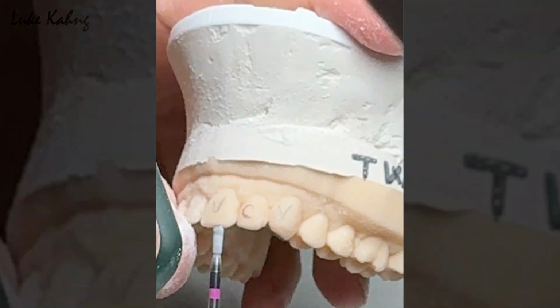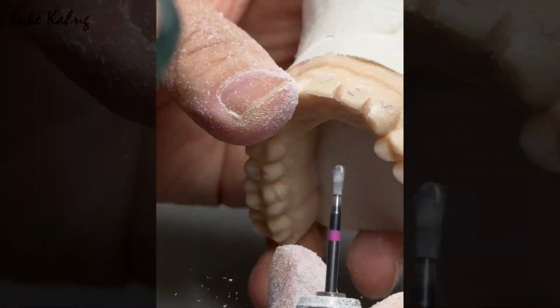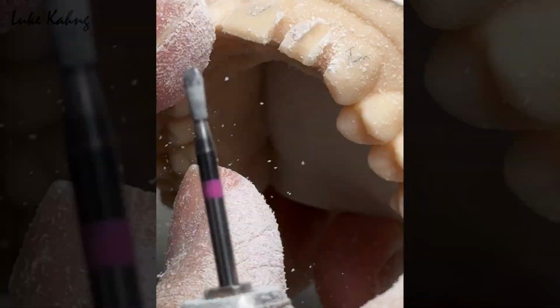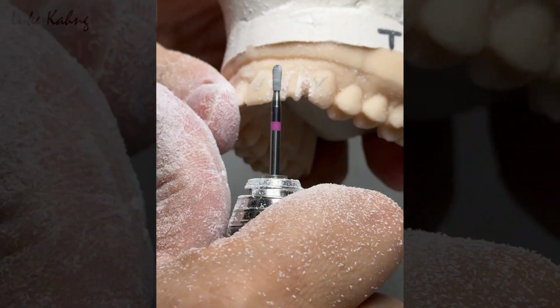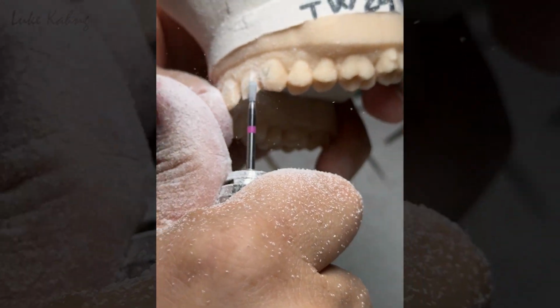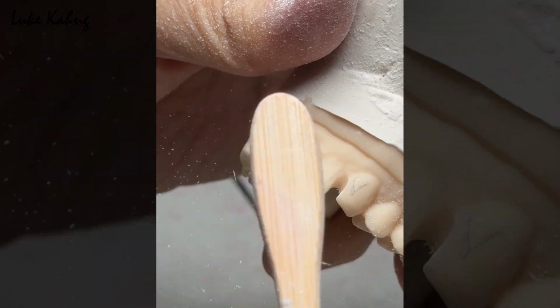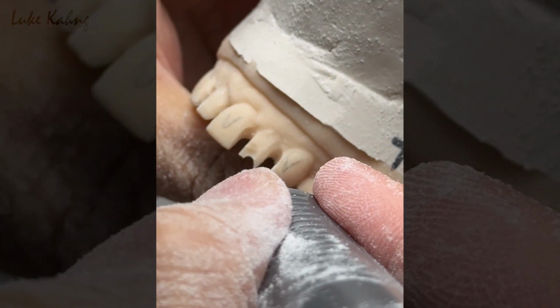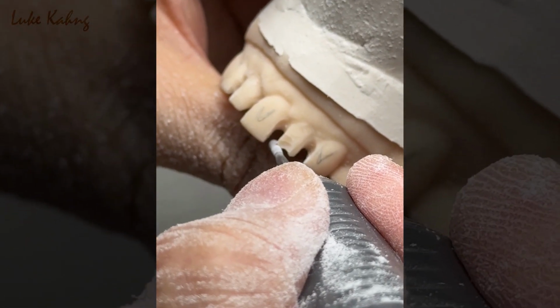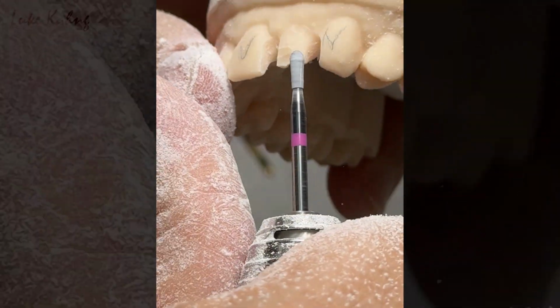Now this is crown prep. To me, this is too tall, too long.